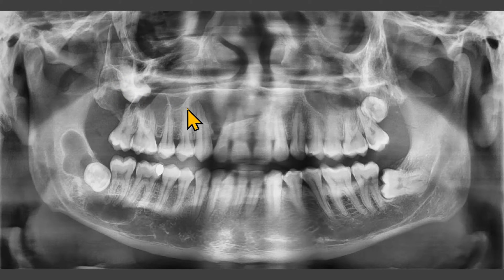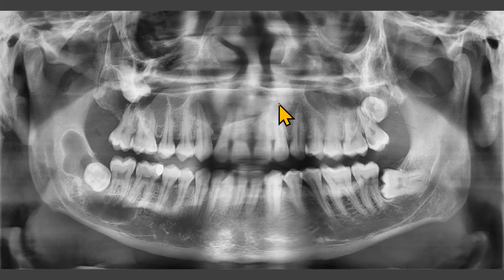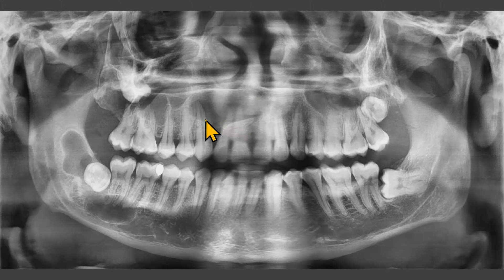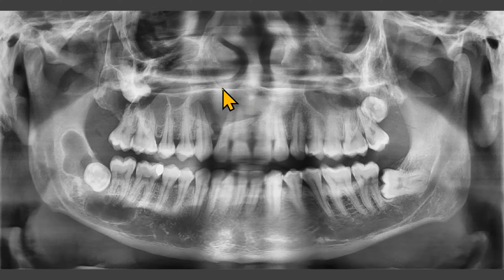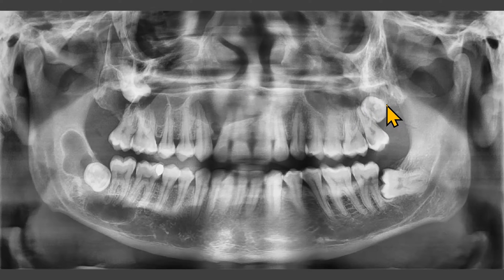We can also see a radiolucency extending from the right first premolar to almost the area of the lateral incisor. The root of the canine and the lateral incisor are separated. This lesion appears to be in contact with the floor of the nasal fossa. The left third molar is impacted. On this panoramic radiograph, we really don't see any lesion.